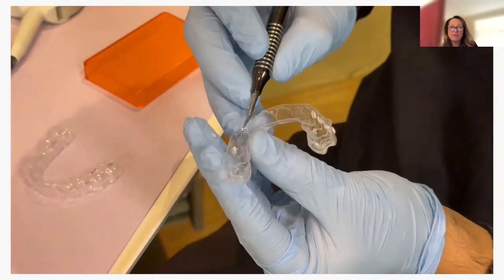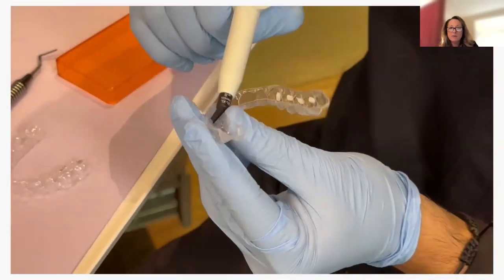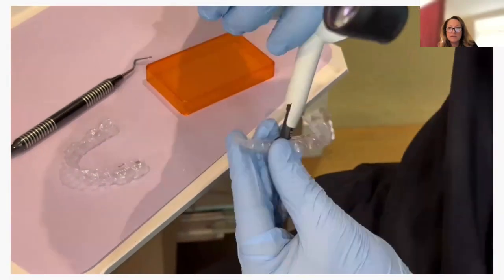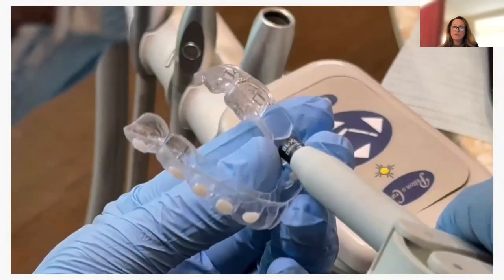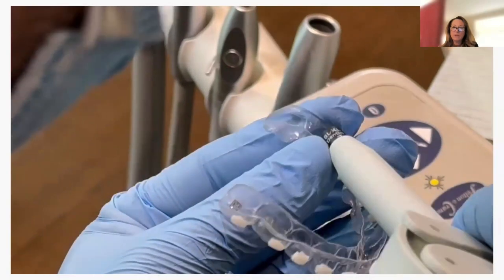As I said, that's not my preferred method. I like to have more control. And I know that, like most of my patients, you retract them and dry, then all that saliva goes everywhere. So now he's loading that.